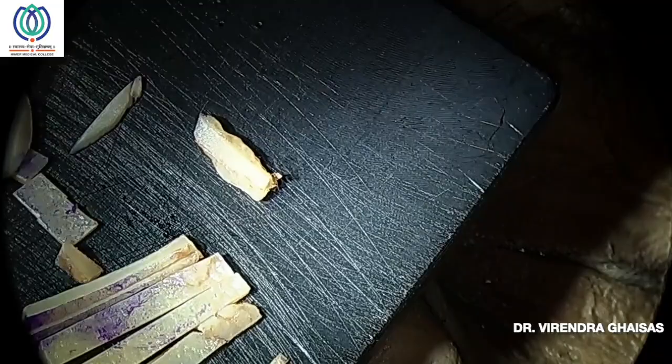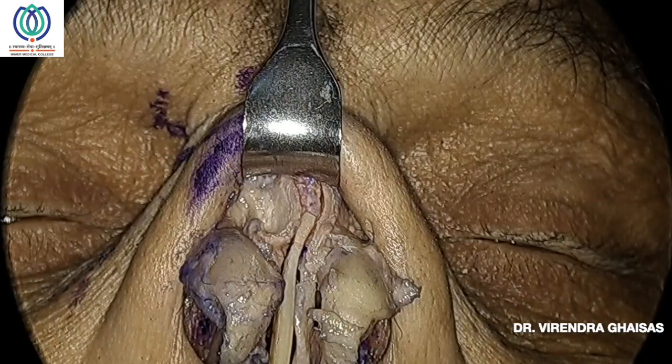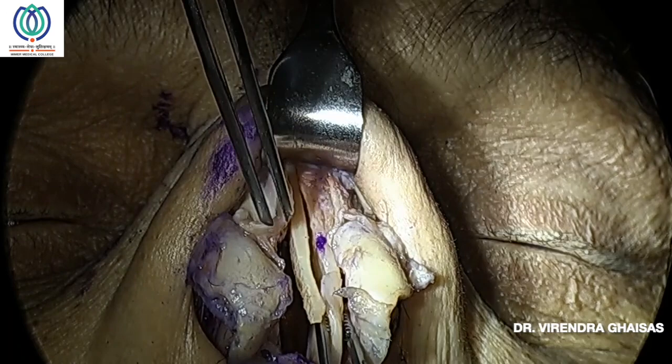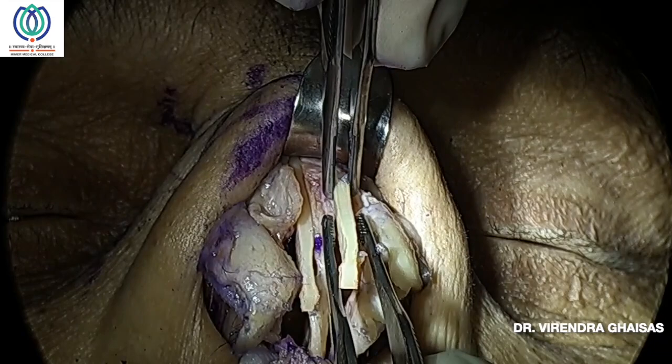Then comes the surgery of the middle one third of the nose, that mainly focuses on the stability of the key junction. So here come the spreader grafts or spreader flaps. In hump nose, after reduction of the septal part of the hump, if the lateral cartilages are 4 millimeters more in height than the septum, then you can turn them to form spreader flaps. If not, then you have to use spreader grafts.